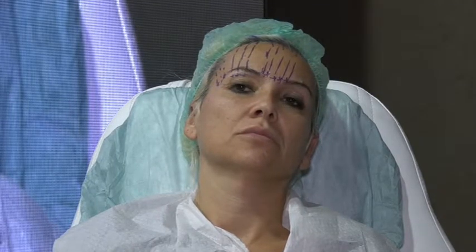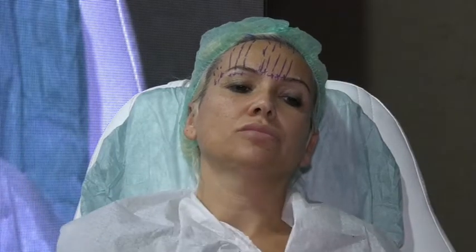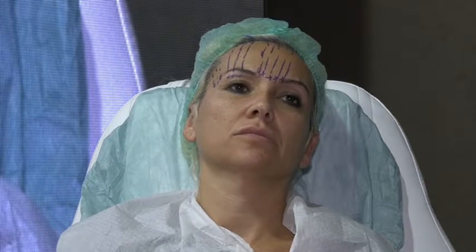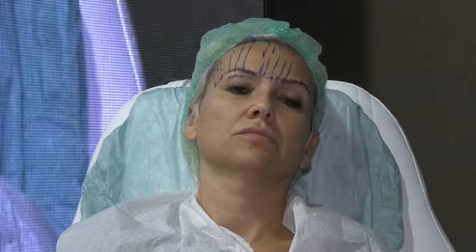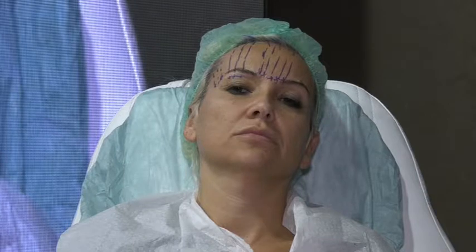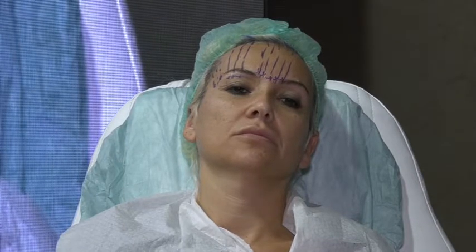But very important, you have to test with your finger. Because if you don't have laxity, if the skin is not moving with your hand, it will never move with the thread. You will never have a result. You have to understand that. If I do like that, and the skin is not moving, because sometimes people say, I did the eyebrow, but I didn't have a result. Okay, because you didn't check if you would be able to have a result or not.